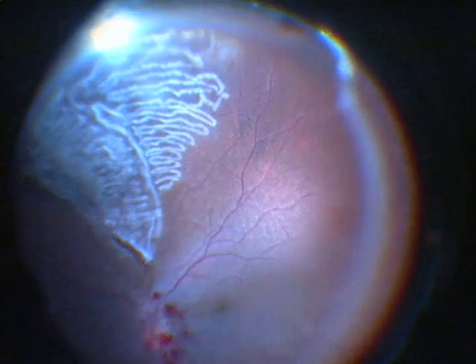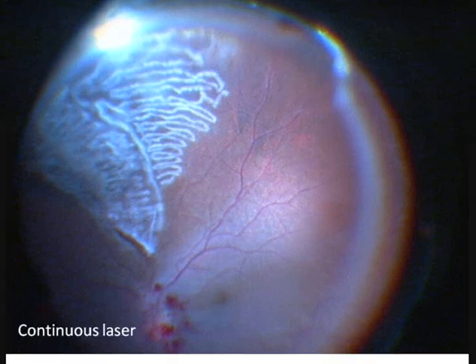Case 4. What is this interesting finding? During vitrectomy, I did something special to the retina. What do you think this is? Well, this is a continuous laser. This is an eye with diabetes, and I performed a continuous laser.